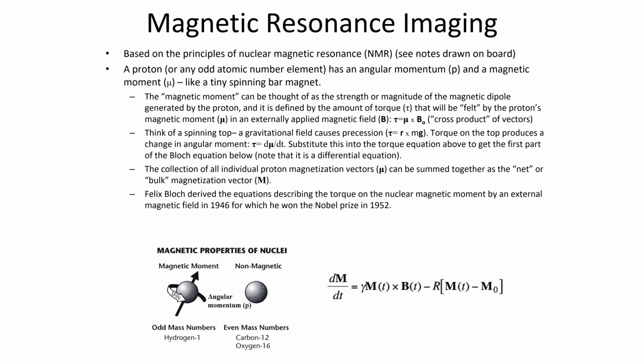Remember, we talked about differential equations and how whenever you have the derivative of something, in this case, the magnetic moment mu, the derivative of that in some way equals itself, the result is always going to be an exponential function, e to the power of something.